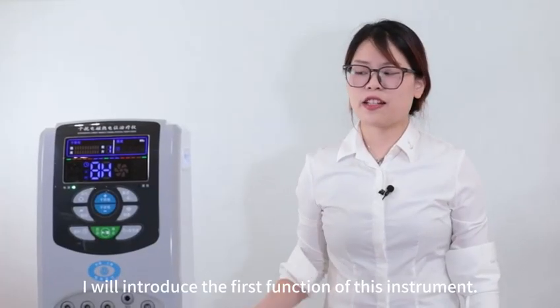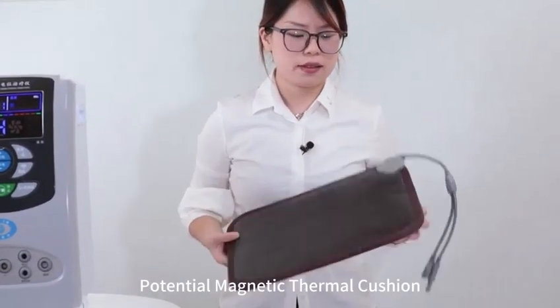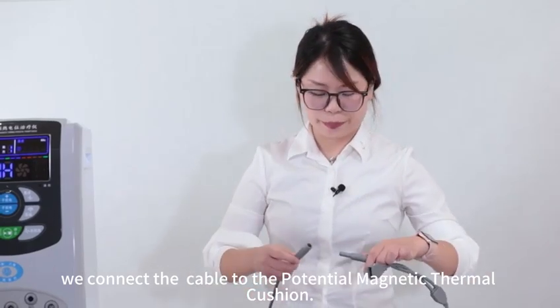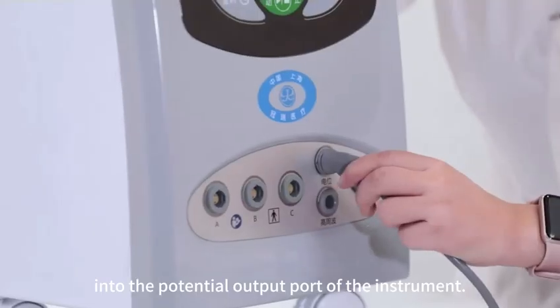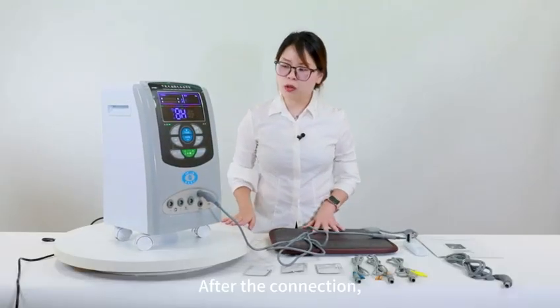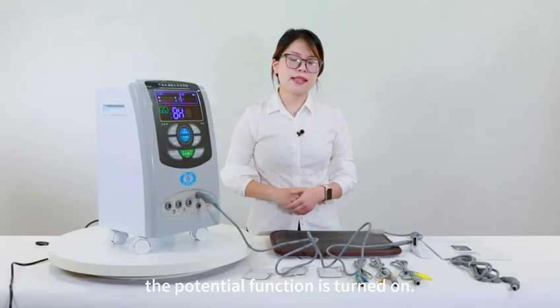Next, I will introduce the first function of this instrument, the potential function. The accessories required for the potential function are the potential magnetic thermal cushion and the magnetic thermal connection wire. Next, we connect the cable to the potential magnetic thermal cushion. After connection, insert the other end of the connection into the potential output port of the instrument. After the connection, click the potential key on the operation interface. The potential function is turned on.